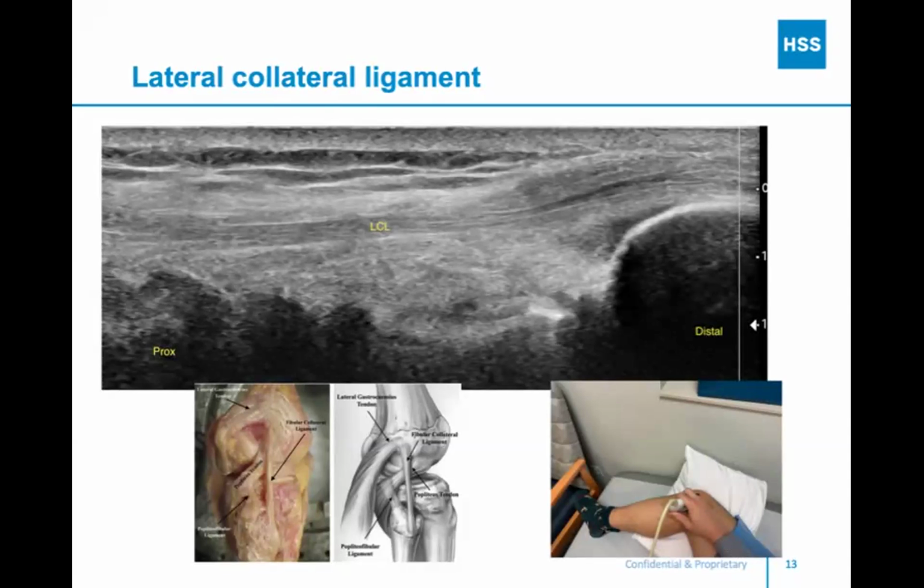And then, you covered the lateral structures pretty well. The popliteus is definitely a challenging structure. When you see the articular cartilage and the tendon diving over, that's a really good sense that you're on that structure, not something else. It is not uncommon for people to get long views of the popliteus or the lateral collateral ligament or something else and think that they're on one structure, but they're really on another one. So looking at those different landmarks to know what structure you're actually on, because there's several that run in very, very similar orientation.